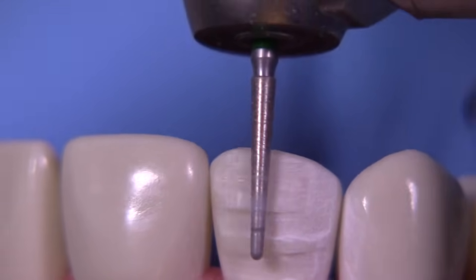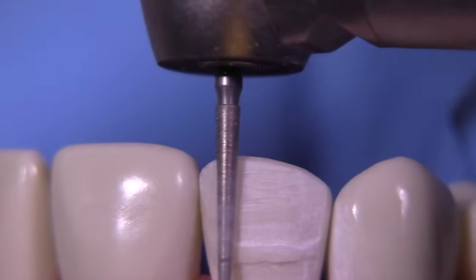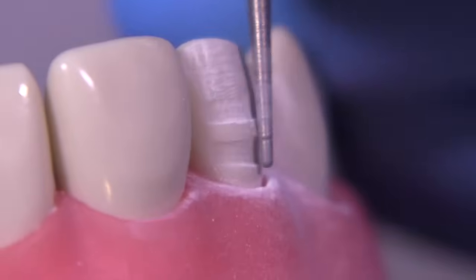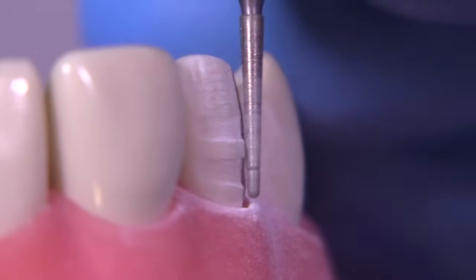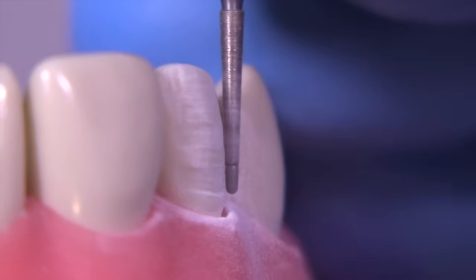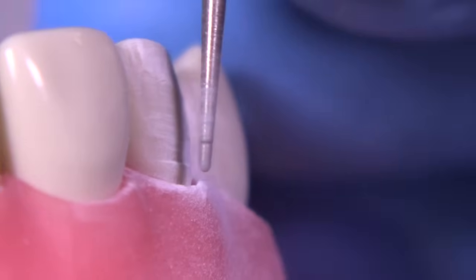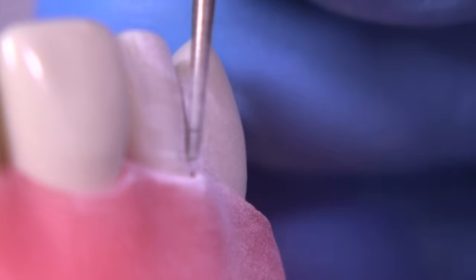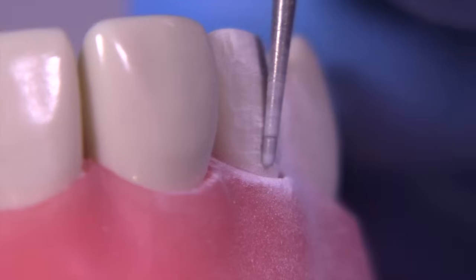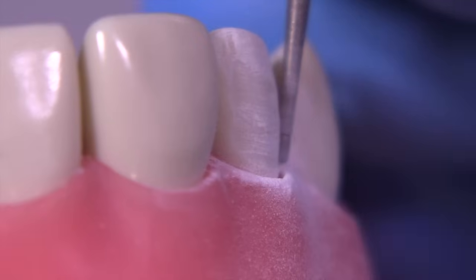So I'm removing right now the middle portion of the preparation between the incisal and middle portion, this little raised area, very carefully, and then I'm going to reorient the burr so that I remove just that portion that's between the middle third and the gingival third. So I have to always think about keeping my burr parallel to the facial surface in order to conserve the removal of enamel. Remember, we're not dealing with a lot of enamel thickness, and I think that frequently we can get so focused on other things while we're prepping that we're not keeping in mind that the enamel thickness in most cases is very, very little.